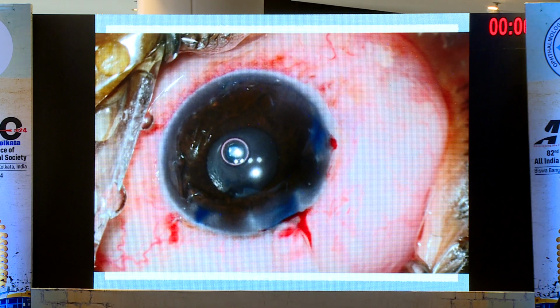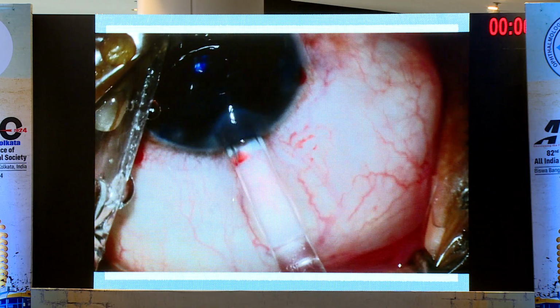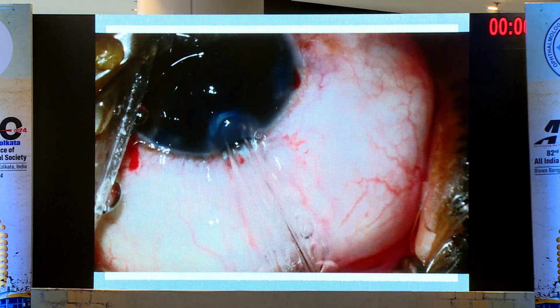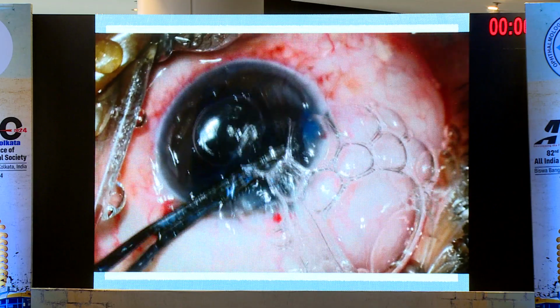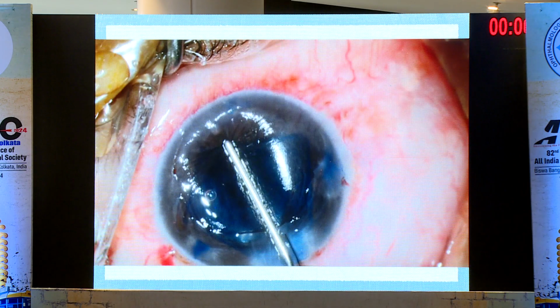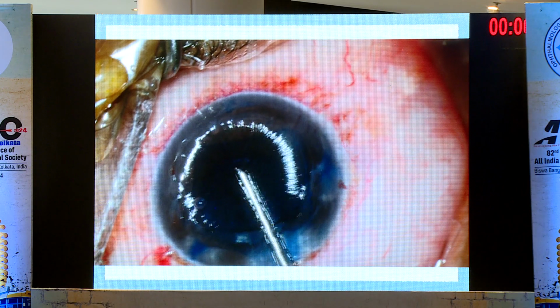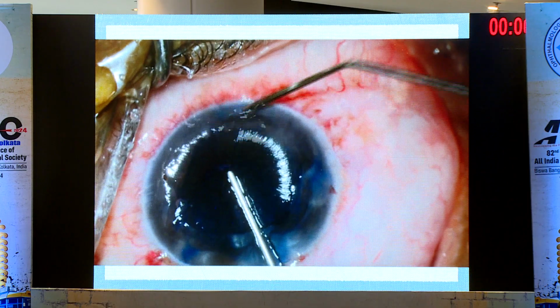And after that, basically, you put in your DMEK scroll. Okay, so you can see that the scroll has gone in. When you've injected, make sure you give some counter pressure before you remove your DMEK glass injector, because otherwise the DMEK graft can follow it, and you'll suddenly have a graft outside the eye. Then you have to do all these tapping maneuvers, which are typical of DMEK, to try and unscroll the edges of the graft.